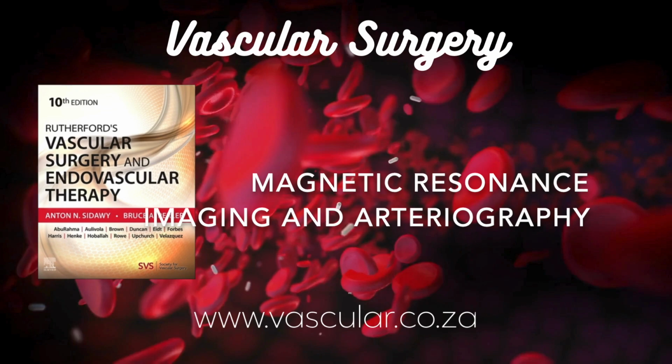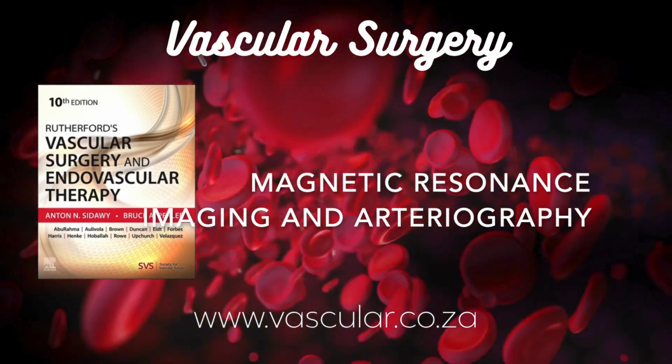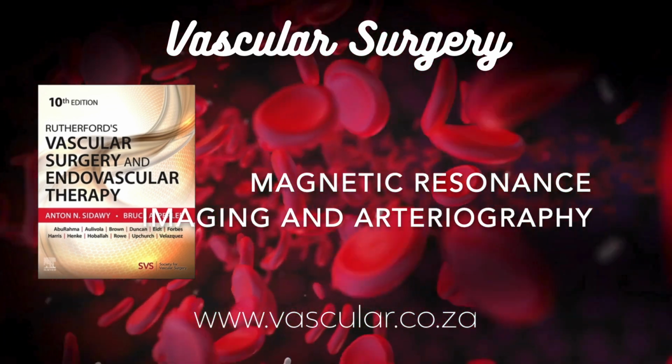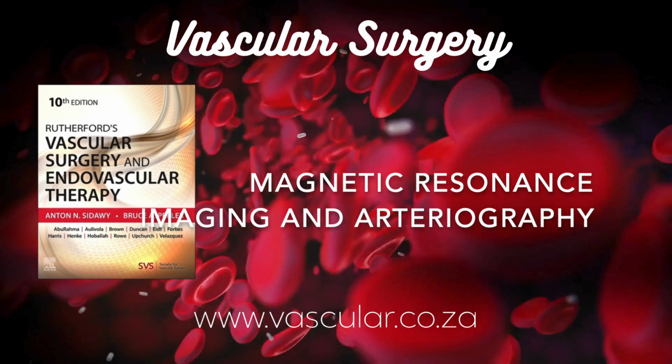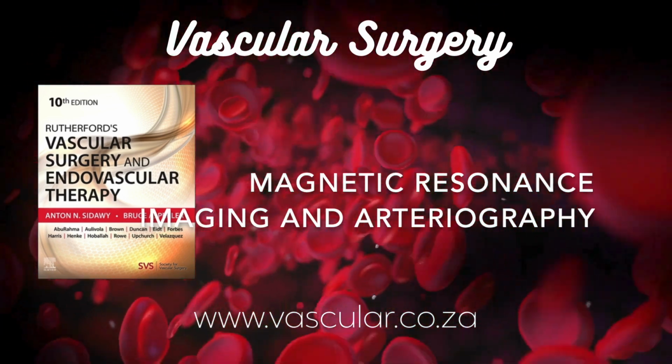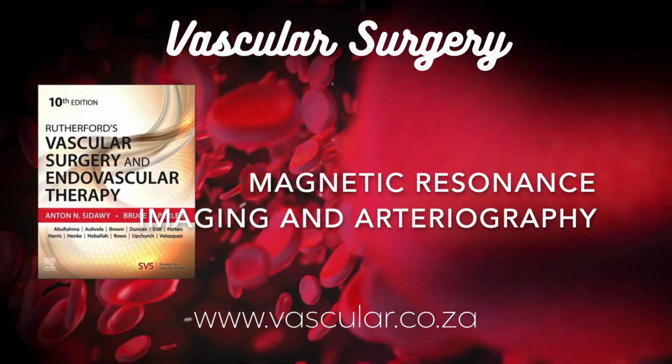While it's not usually a showstopper for standard contrast MRA, it can be a factor for some non-contrast techniques or things like cardiac MRI. Plus, 3T systems cost more and can sometimes be more prone to certain types of image artifacts, so it's a balance. Better signal versus potential heat and artifact issues.